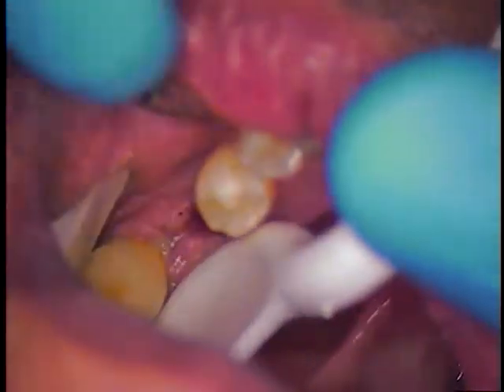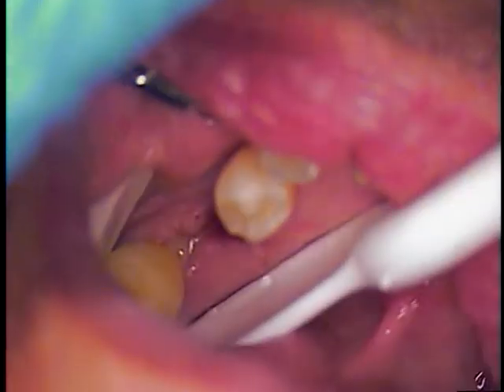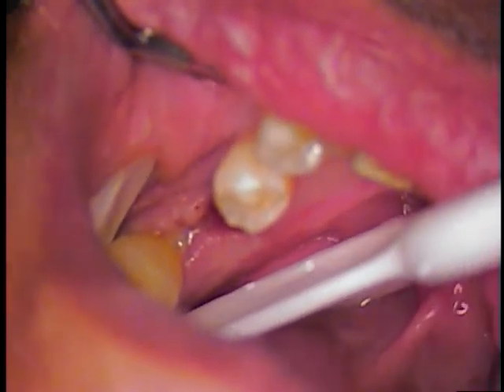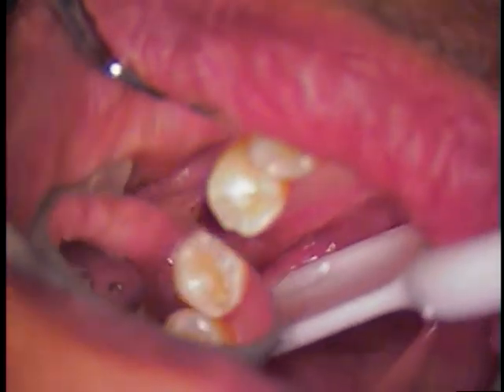Okay, so if we can just position this, I know this has been, hold that. Let me reposition the sublingual so it's a little better on him. Is that all right? Okay. So that stays put. Let's go back in there. Let's see what we got here.